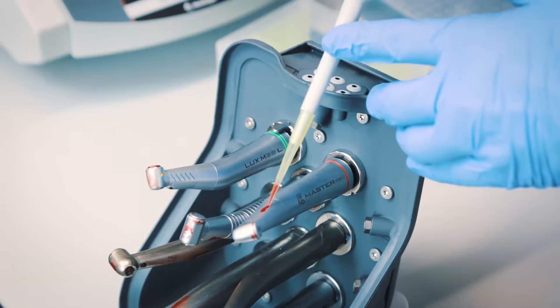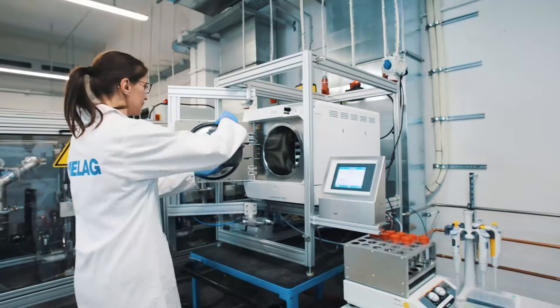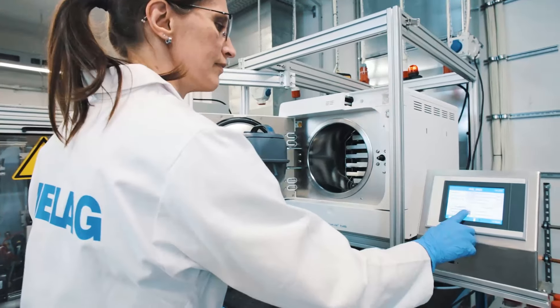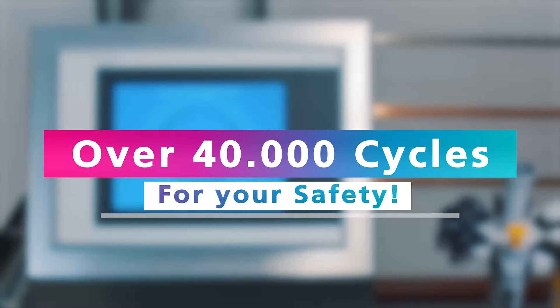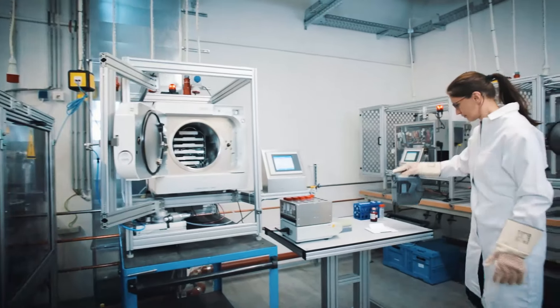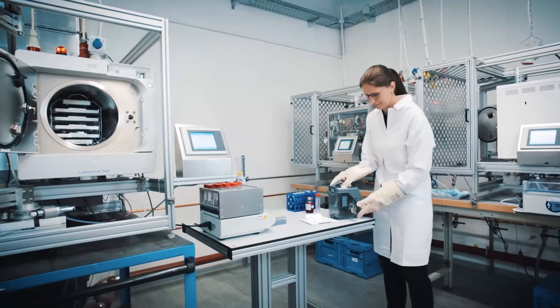With manually applied and automatically dosed sample soiling, three CareClaves were operated in specially developed test stands for over 40,000 cycles. These endurance runs confirm our high standards of reliability and reprocessing outcomes.